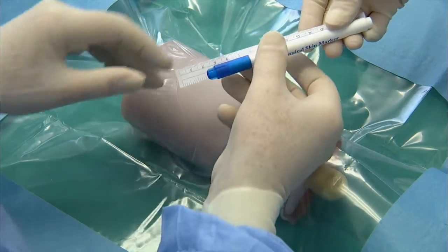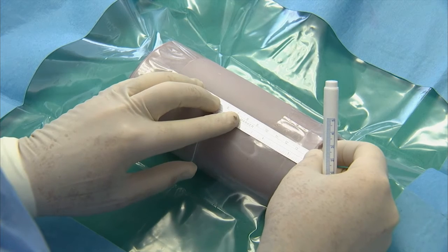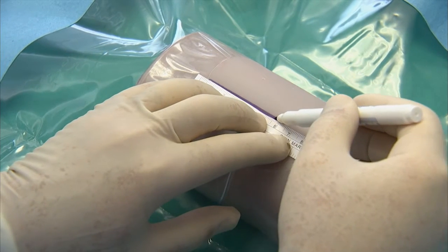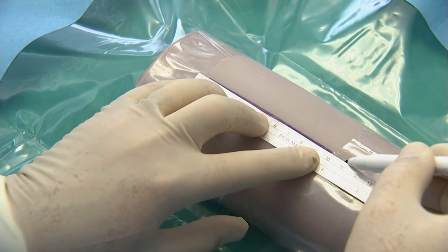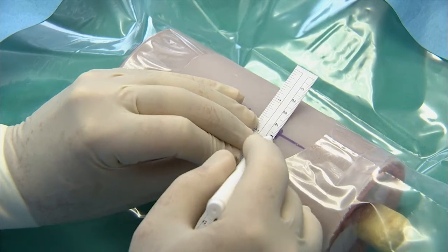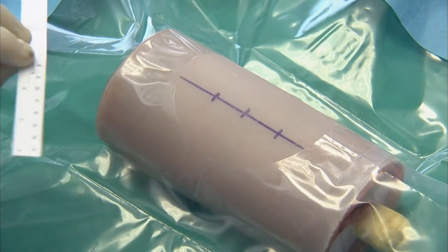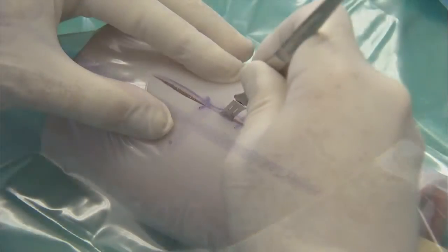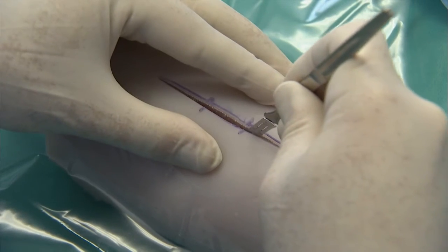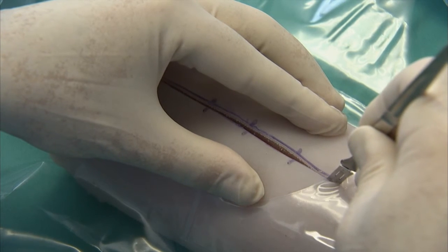Mark your incision over the fracture line with a surgical marker pen while considering adjacent bony landmarks and the underlying anatomy. Ensure that it is a suitable length for unrestrained access. Make a number of cross markings to help you realign the opposing tissue margins during closure at the end of the procedure. Incise the skin, holding the scalpel upright and between 30 and 45 degrees to the skin surface.